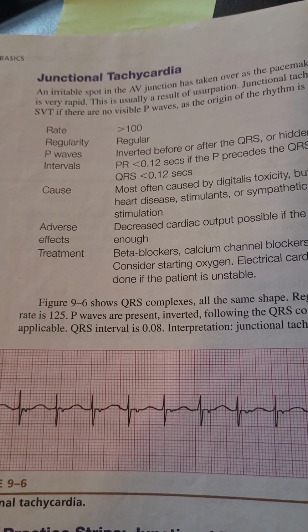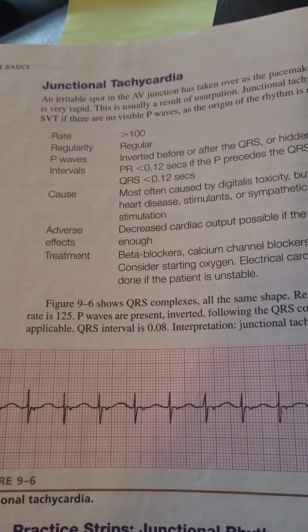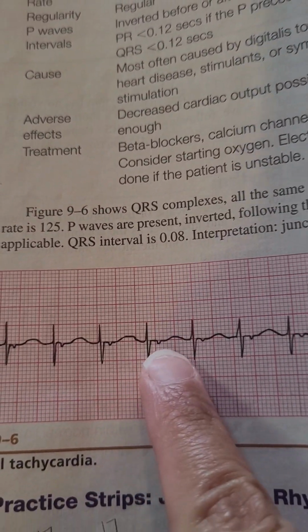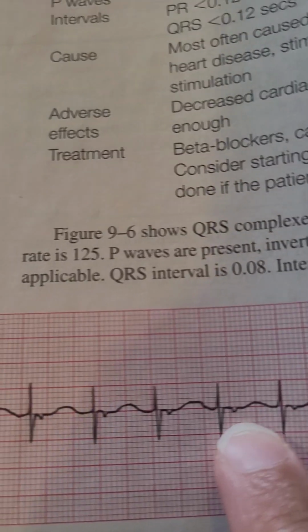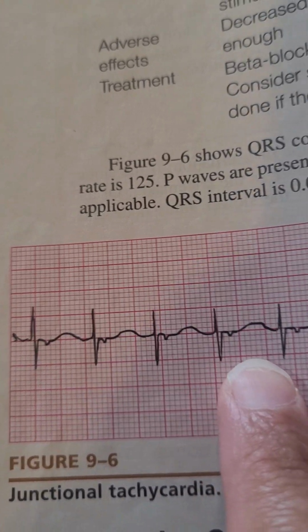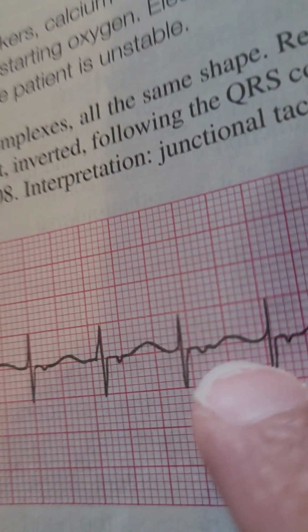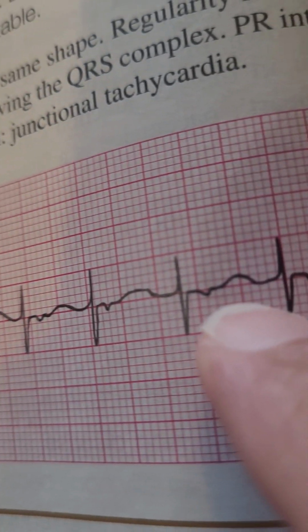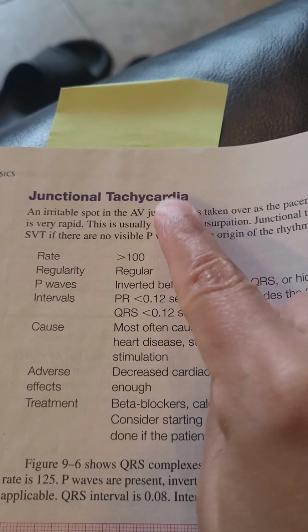Junctional tachycardia, to me, I still sometimes have to look at the rhythm a lot, because sometimes it looks like an SVT, because it says you cannot see the P wave. But if you pay close attention, you can see an inverted P wave after the QRS. You see that? An inverted P wave, and then you see a little T wave. So that's how you know this is junctional tachycardia.